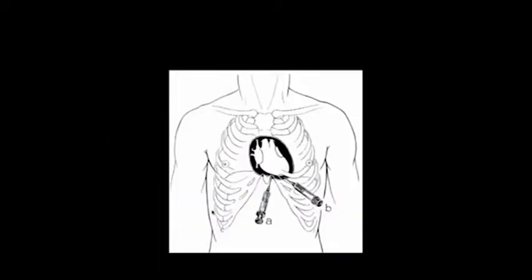There's two particular windows that we use when we perform a pericardiocentesis under ultrasound guidance. That's the subcostal window, which is the more classic window performed usually without ultrasound guidance, and then the apical window, which has gained a good bit of popularity since the use of ultrasound for guiding this procedure. Some people also use a parasternal technique going in the third or fourth intercostal space. However, I prefer not to use this due to the location of the left anterior descending artery. The concept of lacerating that artery just sort of scares me.